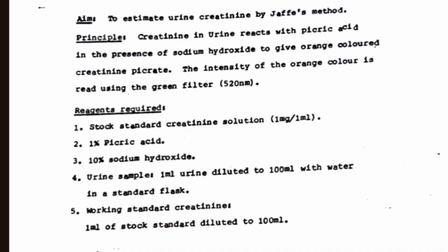Today let's quickly do estimation of urine creatinine, which is a quantitative experiment in biochemistry practicals. The aim would be to estimate urine creatinine by Jaffe's method. Principle, this is very important. You'll have to write the principle in the paper.